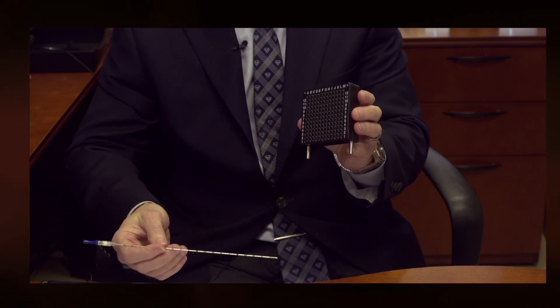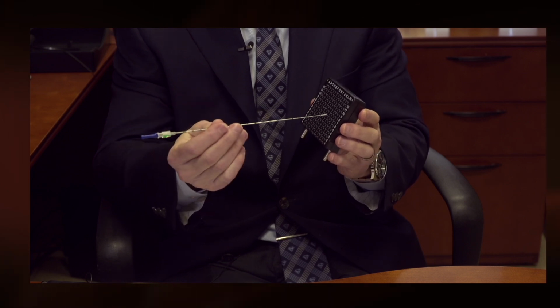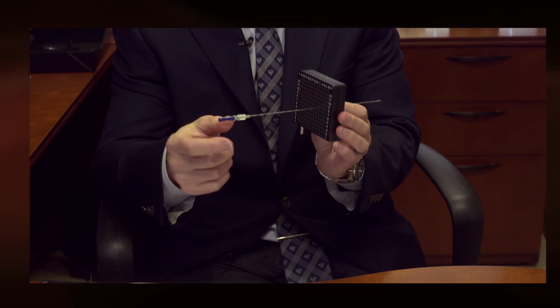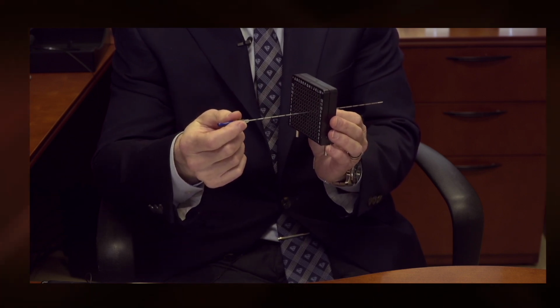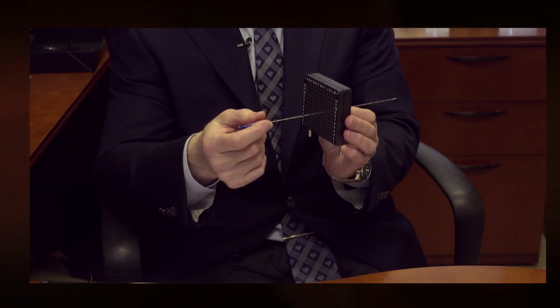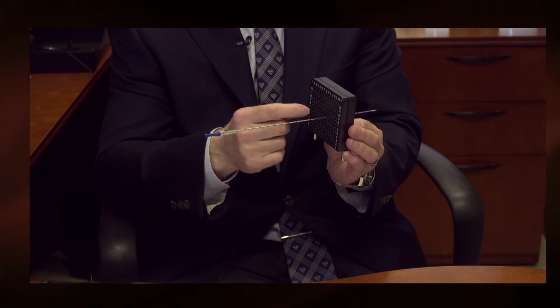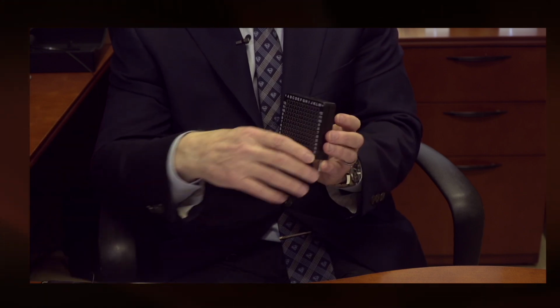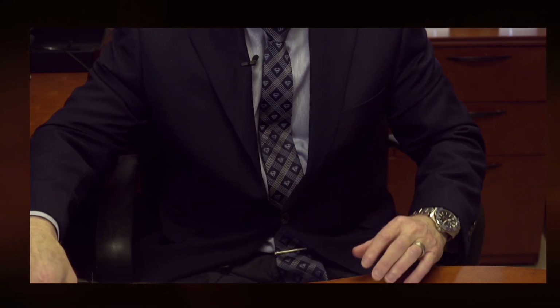Then in a biopsy procedure, we're using a biopsy gun, which is a needle like this with a trigger on it to take the biopsies, but with a seed implant, we're using a needle like this that has seeds preloaded within the needle, and I can put the needle into the skin, up into the perineum, and then up into your prostate gland, which I can watch on this big screen TV and on the ultrasound machine for image guidance during the procedure. And then I can drop the seeds through these needles, and then I remove the needle like that. So the template helps us very precisely place things. It's not a freehand technique like other people use.